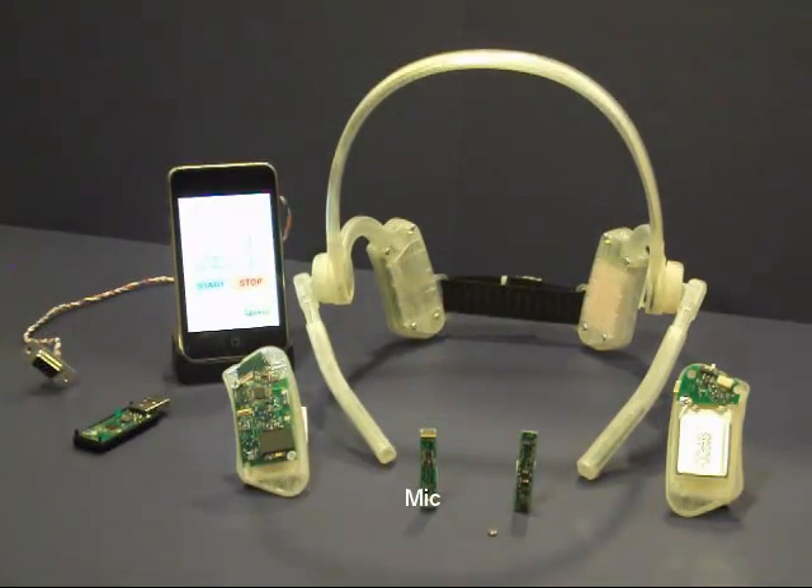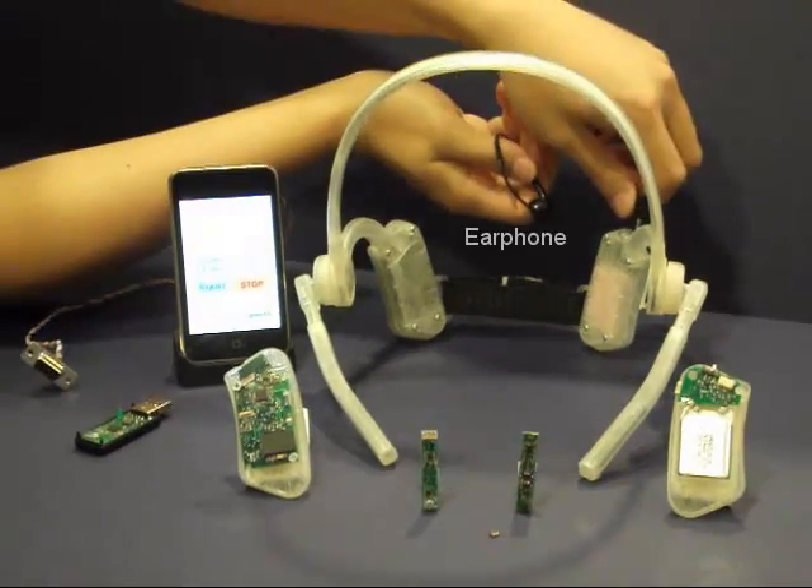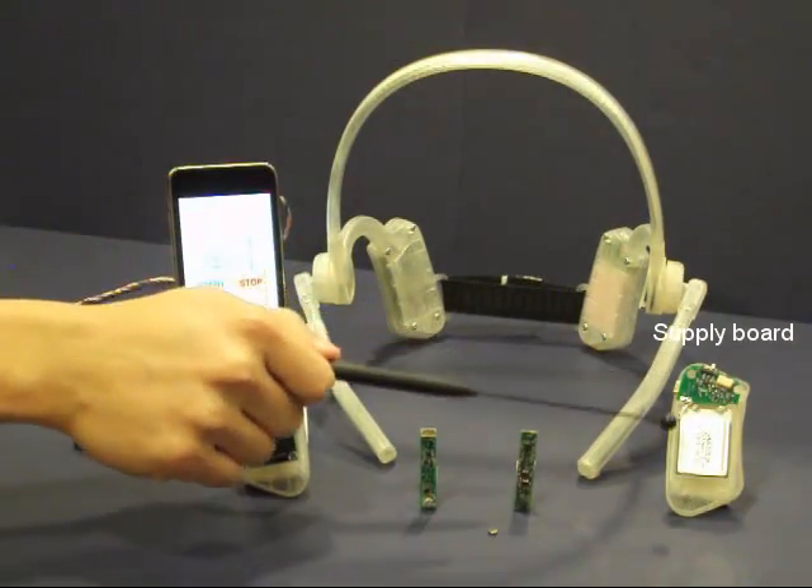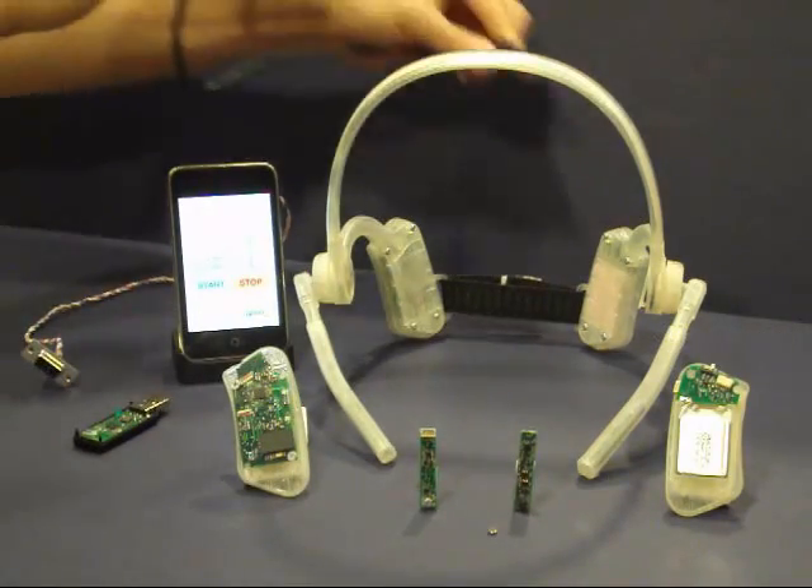The headset also includes a microphone and earphone jack and can be used as a regular headphone for voice control. The system can continuously run for two days and can be recharged through USB.